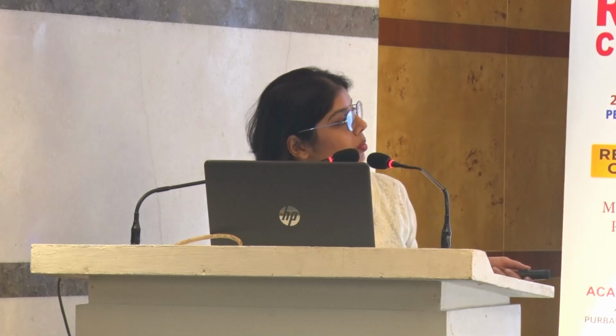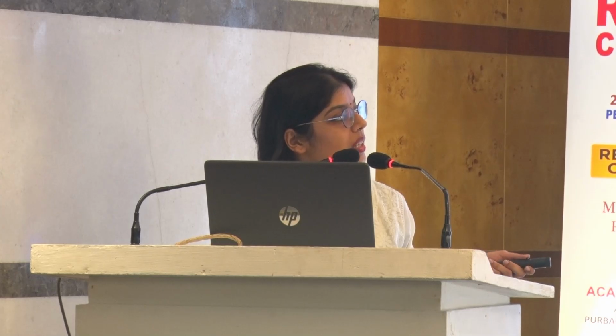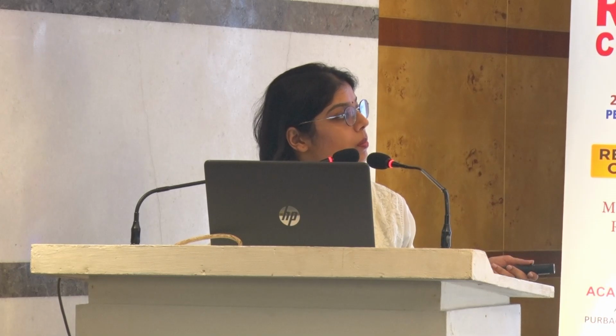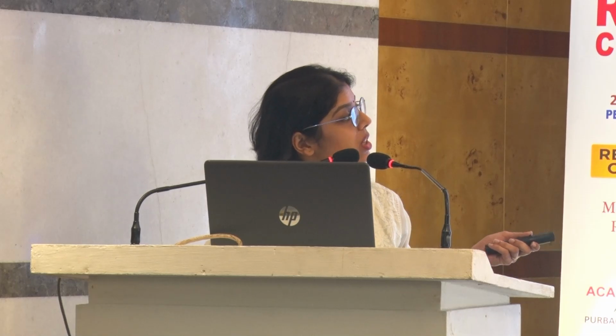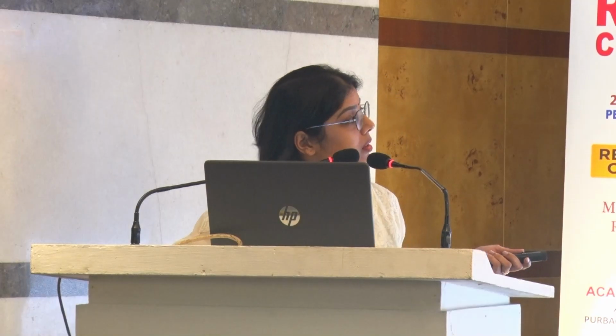So this is our departmental image. This is again a longitudinal scan of the wrist joint where we can see grade 3 synovial proliferation. This hypoechoic area arising from the intercarpal and the radiocarpal joint is the proliferated synovium. And this longitudinal structure running on top is the fourth extensor tendon. So there is grade 3 synovial proliferation here.